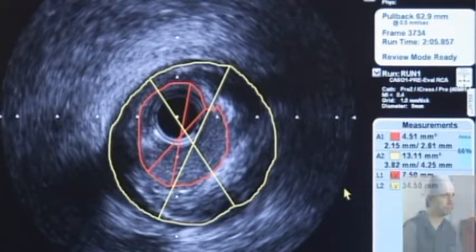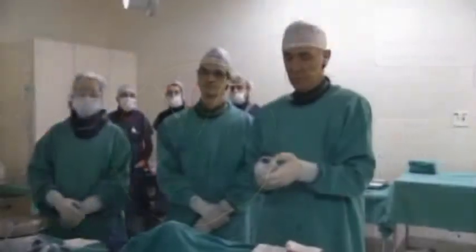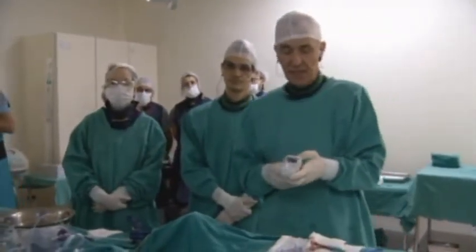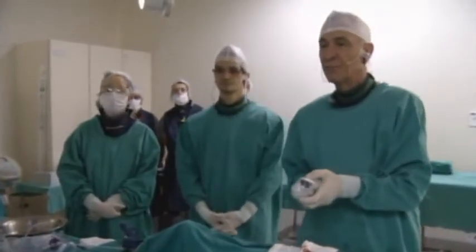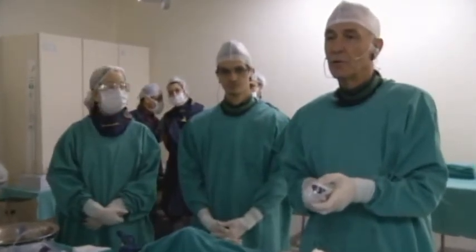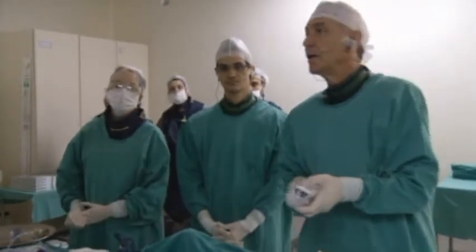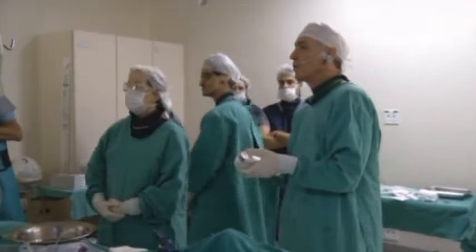Okay. So based on these IVUS results, we decided to pre-dilate the distal lesion. It's a very tight lesion, so we did the pre-dilatation of it. I'm sorry, to show you the IVUS run is for better understanding and better comprehension. If you have the run of the IVUS, it would be better.